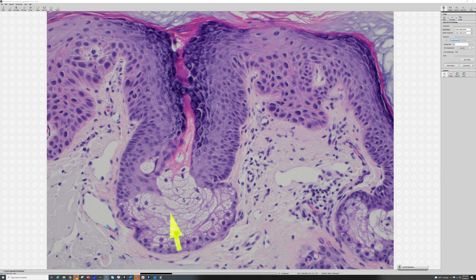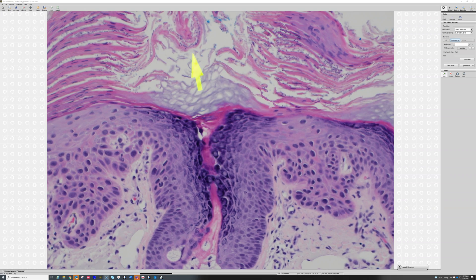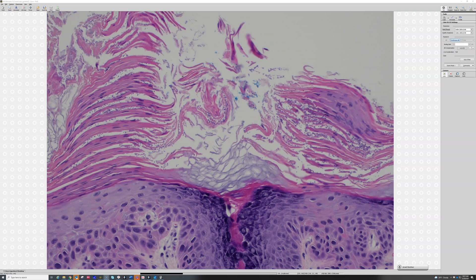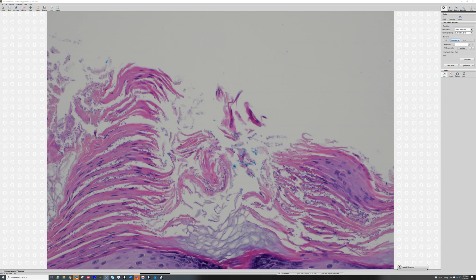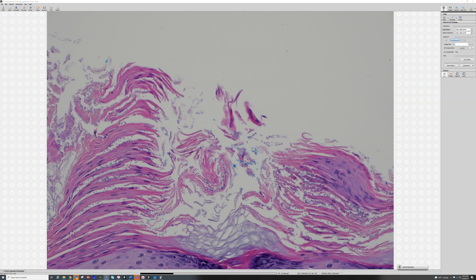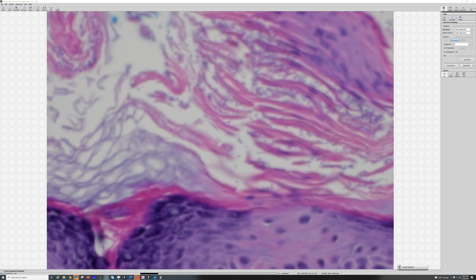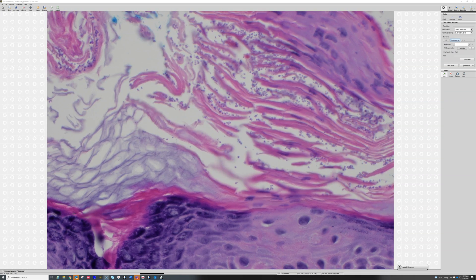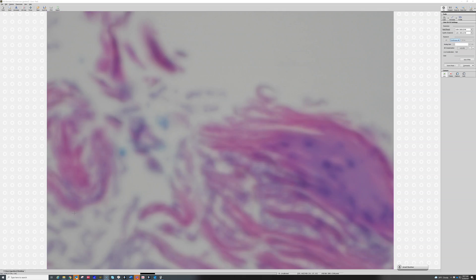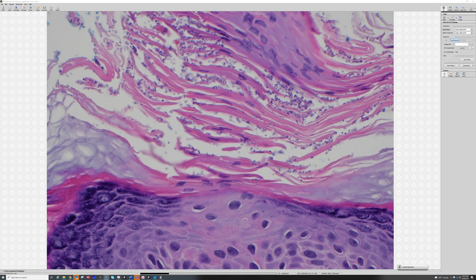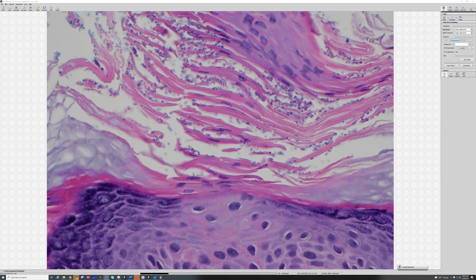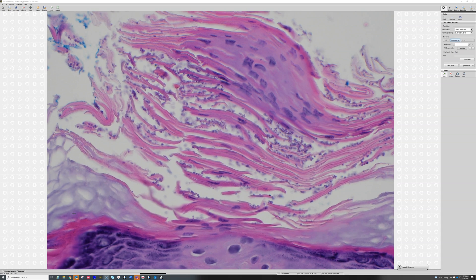That fatty, greasy oil comes out the hair follicle opening to the surface and normally gets wiped off your skin. But if you've got a nice thick corneal layer, it can get kind of trapped in there and provides a happy home for these fat-loving yeast to grow and thrive. You can tell they're yeast because they're round and budding. This is on 40x — 400 times magnification — and you can see the round yeast with little tiny buds up the side.